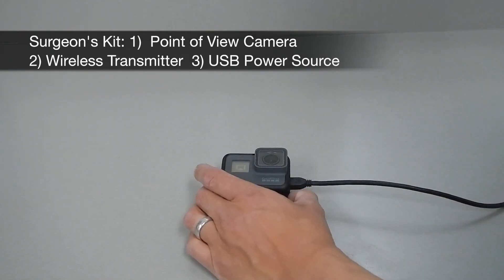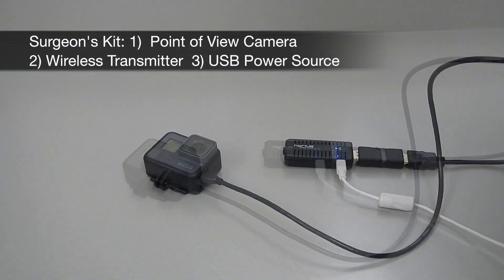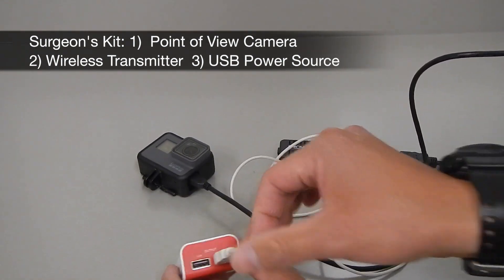An HDMI cable connects the point-of-view camera to the wireless transmitter, and finally this is all powered by a portable USB power source.